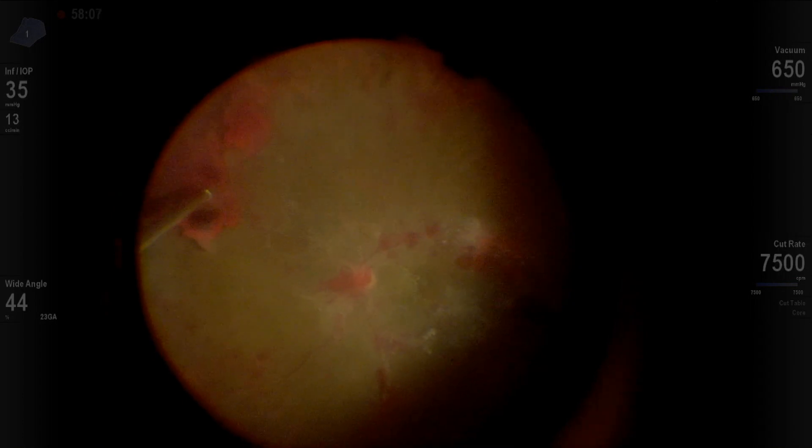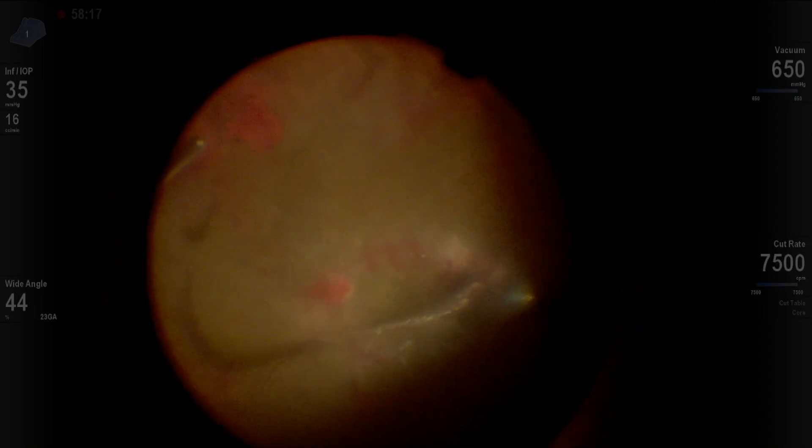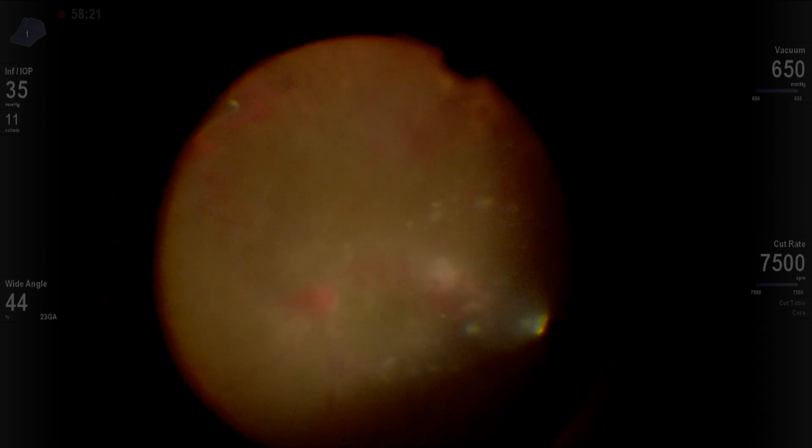We finished this case by doing laser. We did not do any ILM peel, which we don't do routinely in diabetics, and we left the eye air filled. Thank you.